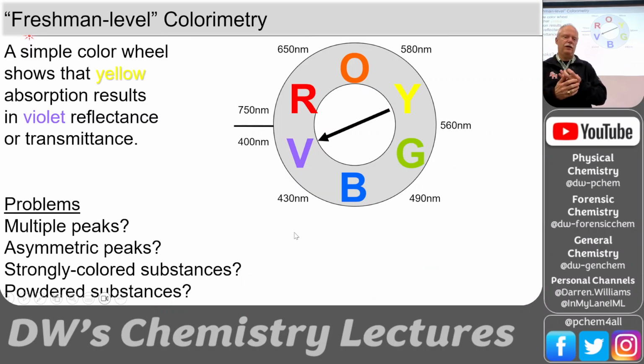Now, let's talk about colorimetry. We did the color lab, the RGB color lab, so let's review a little bit of that. This is the freshman level colorimetry, where if you have a big absorption peak in the yellow part of the spectrum, you're going to get blue light and red light through that substance. So if it absorbs the yellow, it's going to look purple. And so that's what we have with the color wheel.